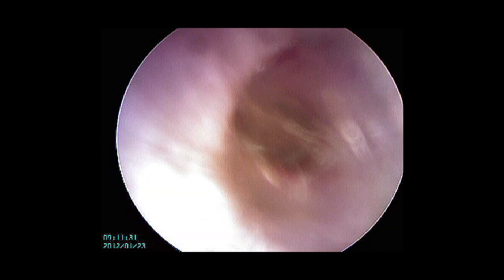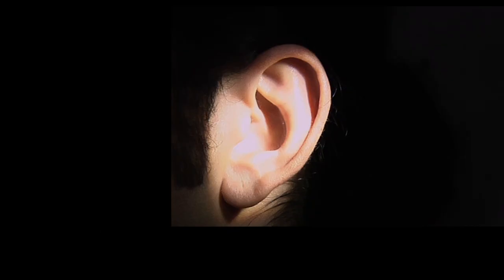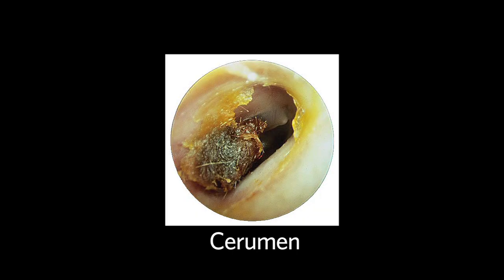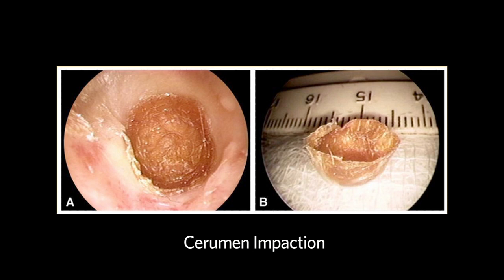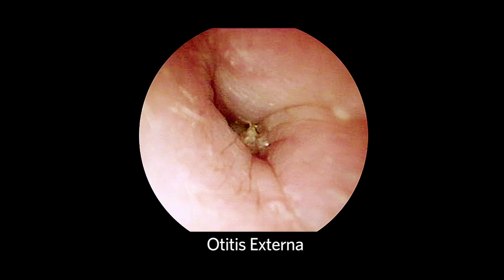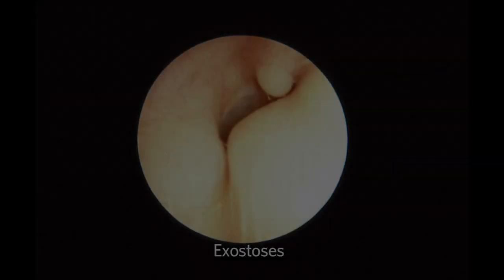The ear canal has a lateral cartilaginous and medial bony component. The cartilaginous component has the same color skin as the individual and contains the glands that manufacture cerumen. The bony canal skin is usually pink in color, thinner, and therefore sensitive when examined. Common abnormalities include cerumen impaction, otitis externa, an osteoma, and exostosis.